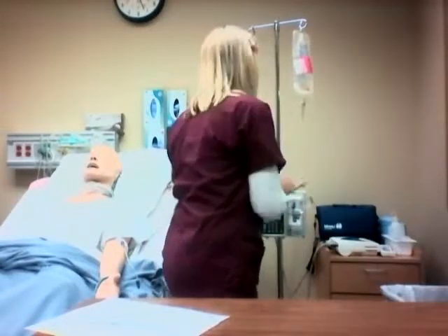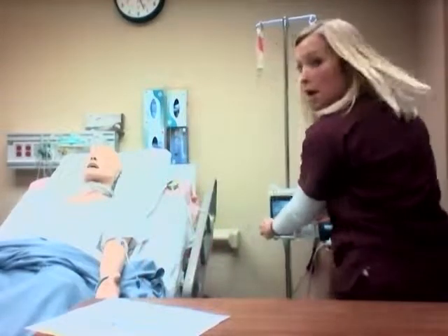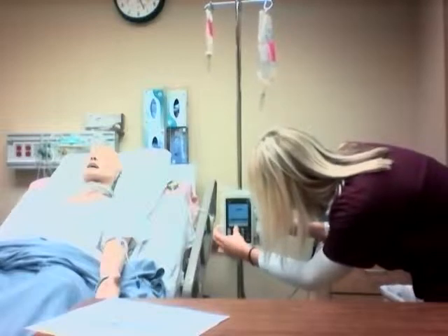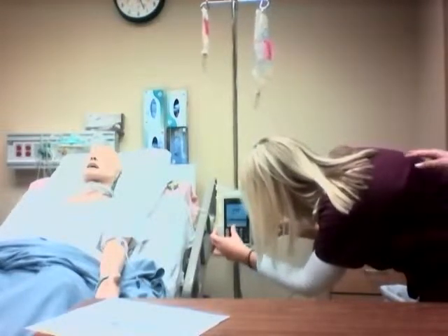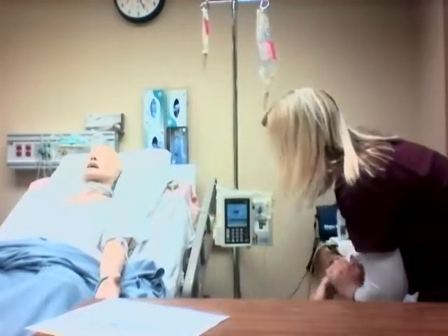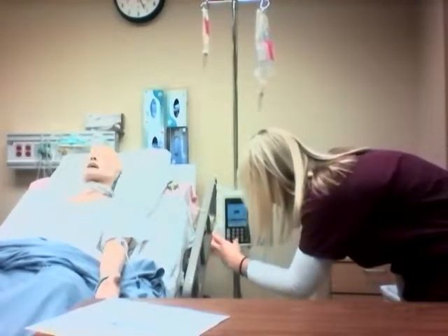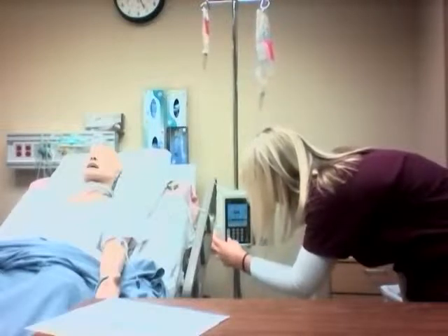Okay, so I've got it connected, and I'm going to set up for line B. Okay, so I'm going to select line B, and I'm going to change mode to concurrent, and we are going to be infusing 10 mils per hour.